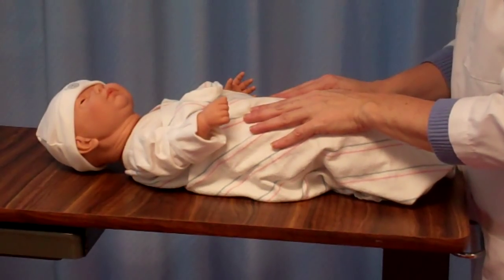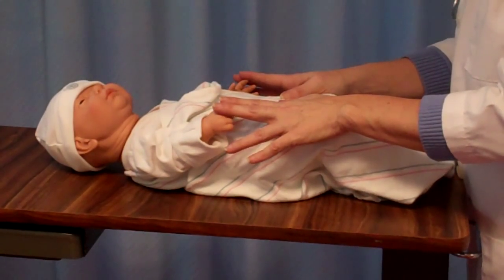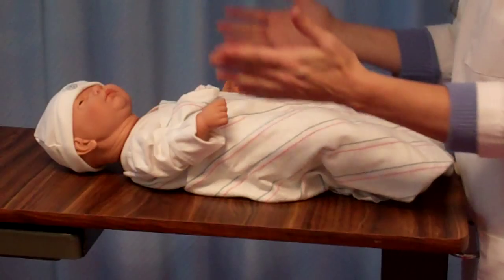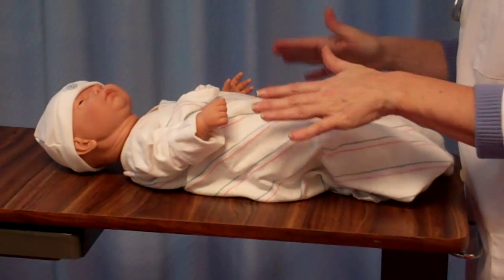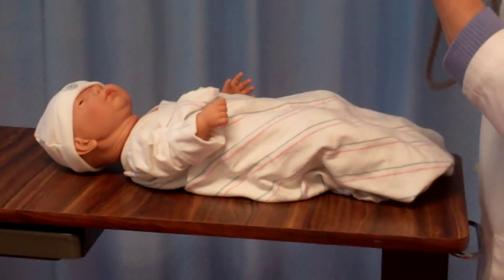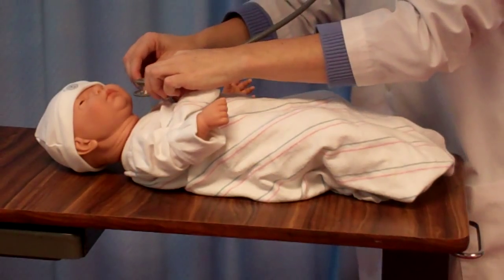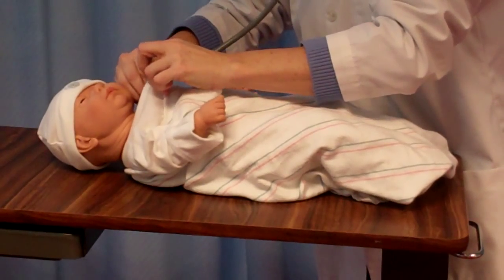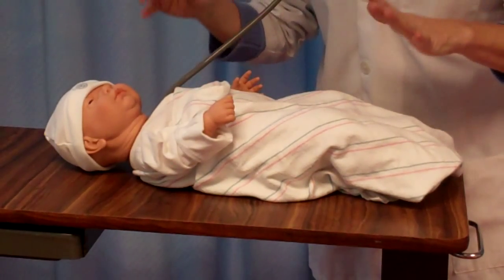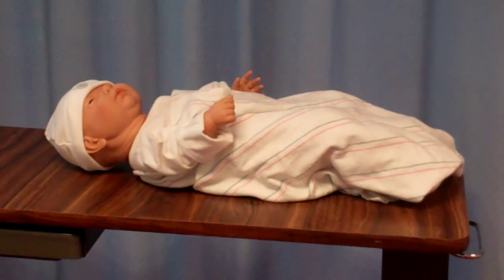Today we will be doing a newborn assessment. The first part of your newborn assessment is to obtain your vital signs. We want to get our heart rate first before we unwrap the child and make them cold, or before we disturb the child and make them start to cry. So we want to try and tuck our stethoscope in under the clothes, against the skin, and try to get our heart rate without disturbing our child. Once we get our heart rate, we can then move on to do the rest of our newborn assessment.